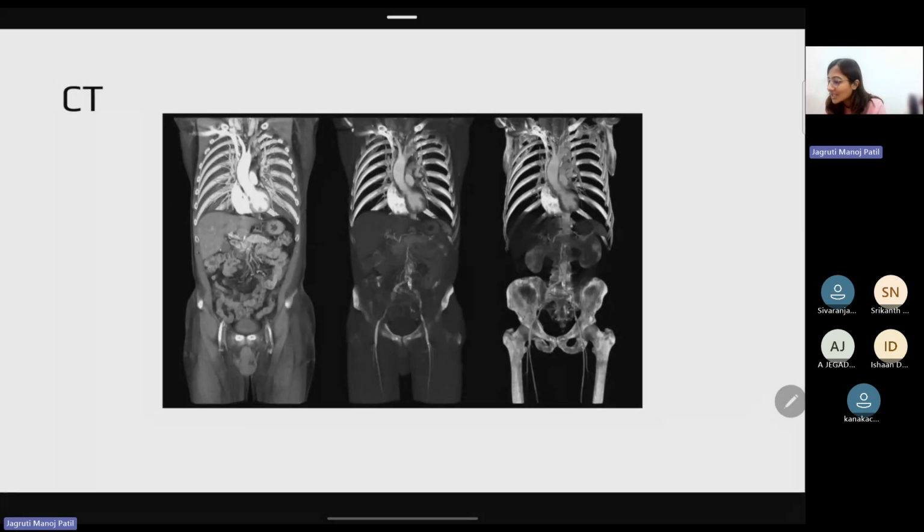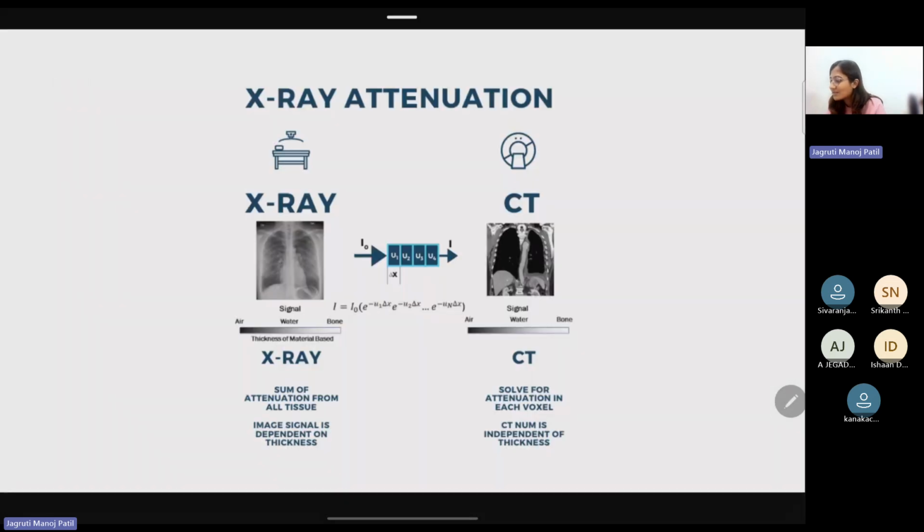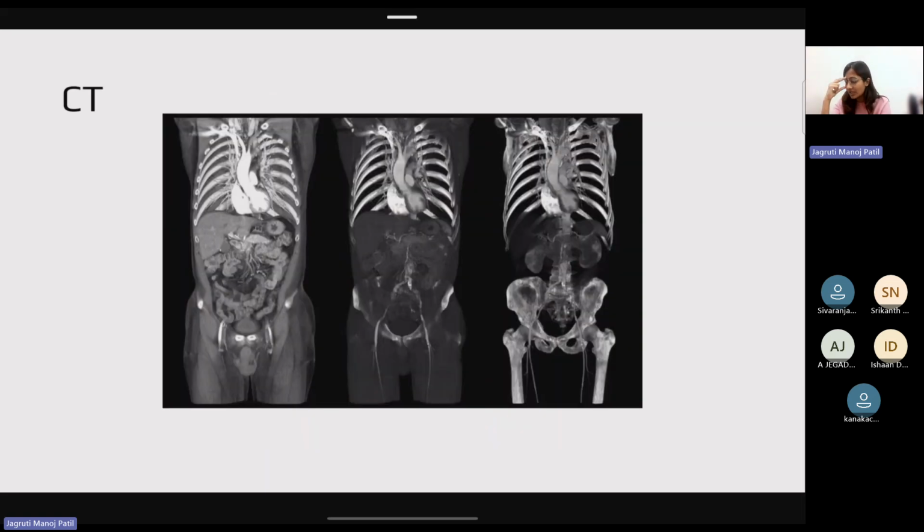And now you might question why the previous one looked like this. This image is an end image, the filtered back projection image, hence you're getting a very clean image, and below you see these white dots in here. If you adjust the scale bar, you'll be able to see the bones in those cases if you decrease it, whereas in this case it's the very first preliminary scan. This is from my research directly, so this is raw data that I'm showing you here. So that's how you look at different planes and angles over here.